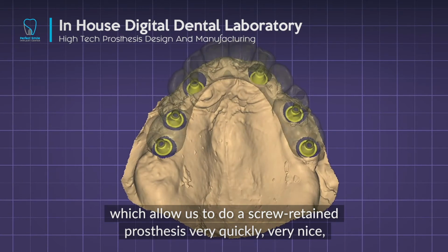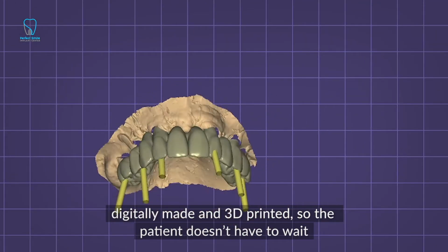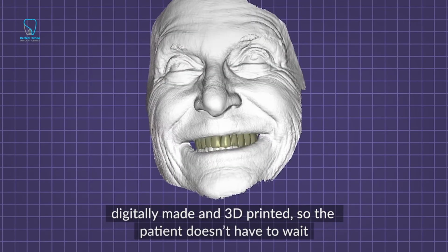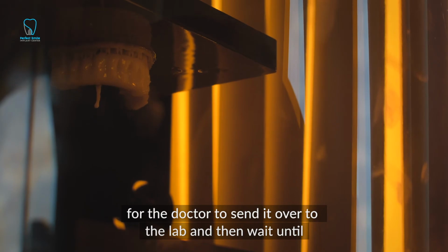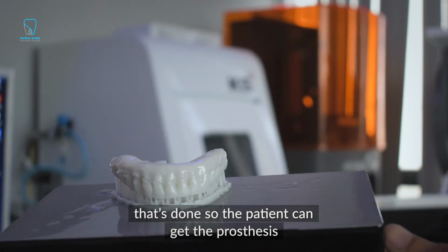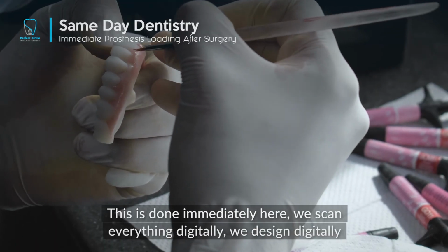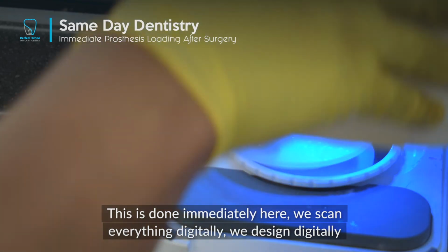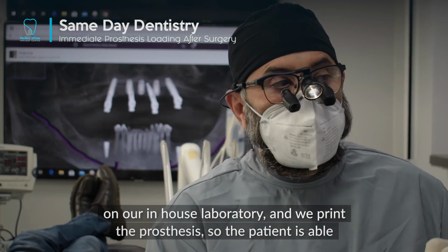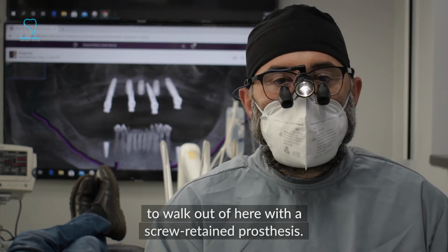screw retained prosthesis very quickly, very nice, digitally made, and 3D printed. So the patient does not have to wait for the doctor to send it over to the lab and then wait until that's done so the patient can get the prosthesis. This is done immediately here. We scan everything digitally, we design digitally in our in-house lab, and we print the prosthesis. So he's able to walk out of here with the screw retained prosthesis.